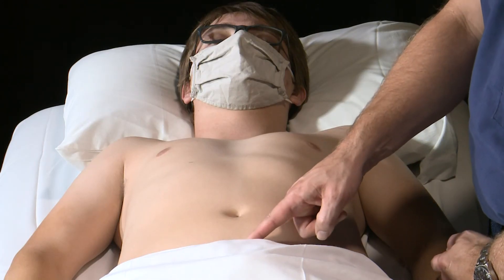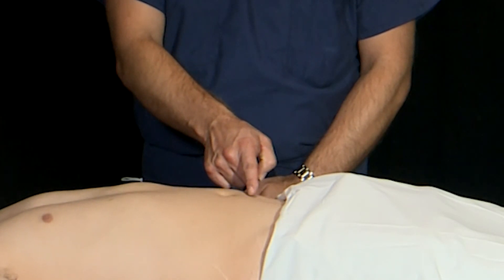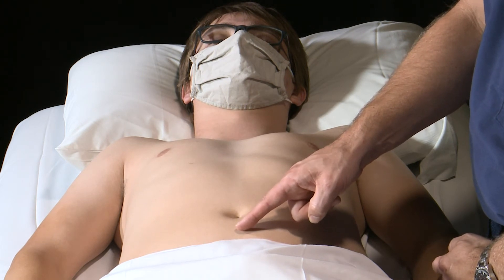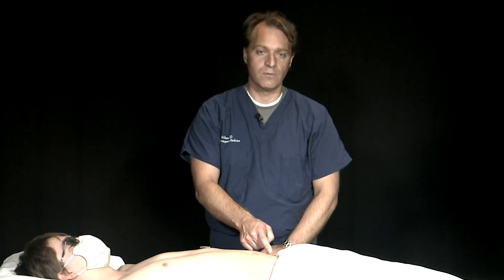The third view of the FAST exam is going to be looking in the pelvis for free fluid. To do this, we generally look in two different orientations. The first is the sagittal view, where we're going to place the probe just above the pubic symphysis with the marker dot pointed towards the patient's head. After we've imaged the sagittal view, we'll rotate the probe 90 degrees, again just above the pubic symphysis, looking in this orientation for free fluid.